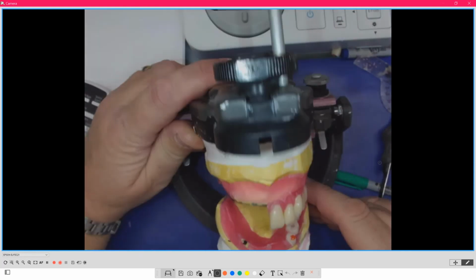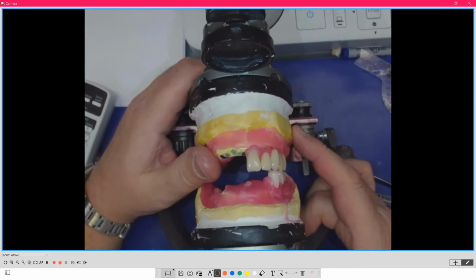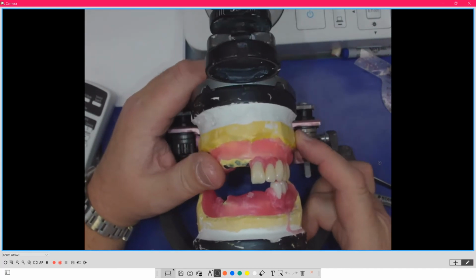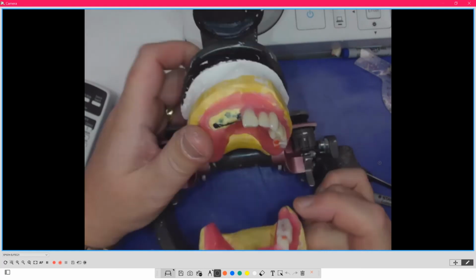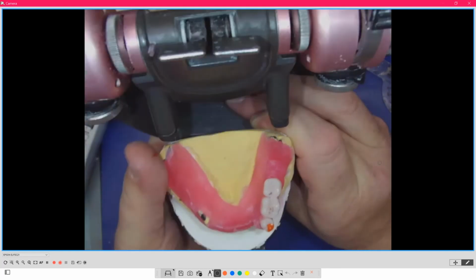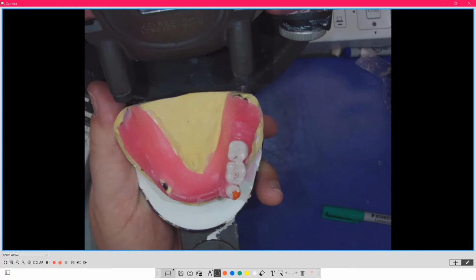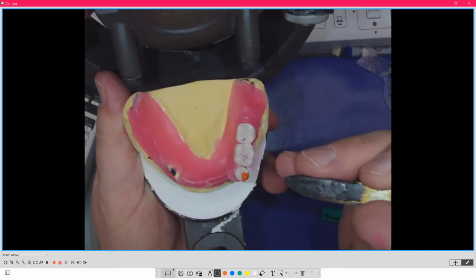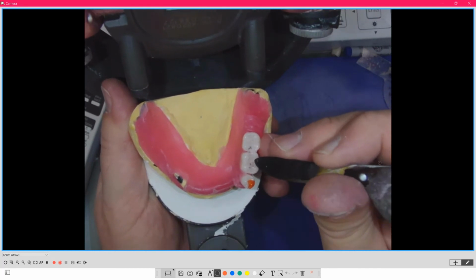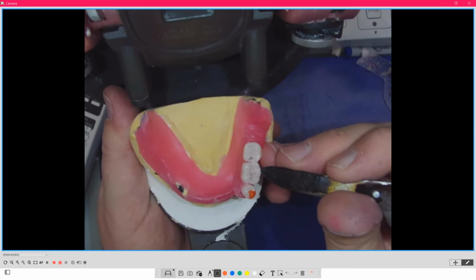And now what I'm going to do is take the articulator, open it, and do a chew cycle. So I'm going to follow a chew cycle. And now I'm going to look and see where the marks are. So again, I'm going to hold it up. And again, I'm going to apologize because I can show this to you way better in person than on a camera. But you're going to see there's some little bit of marks right here on the guiding plane, which meant that cusp hit and slid in with that facilitated chew cycle that I just did.